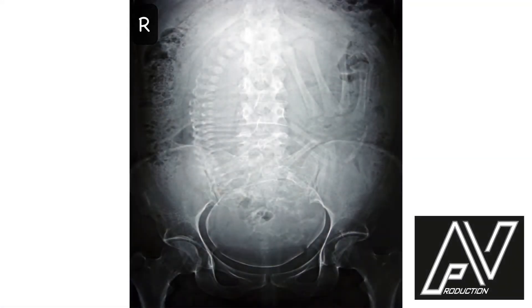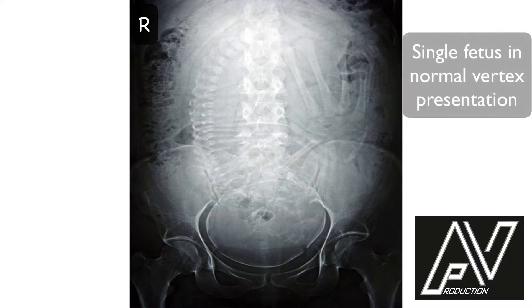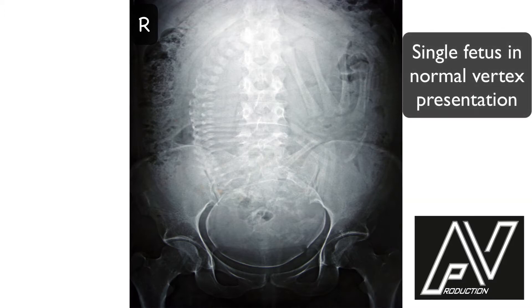This is a plain x-ray of the abdomen and pelvis, AP view, well centralized, well exposed, showing a single fetus in longitudinal lie, flexed attitude, cephalic presentation with vertex as the presenting part. There are no obvious fetal skeletal abnormalities. Therefore, my diagnosis is obstetric x-ray showing a single fetus in normal vertex presentation.